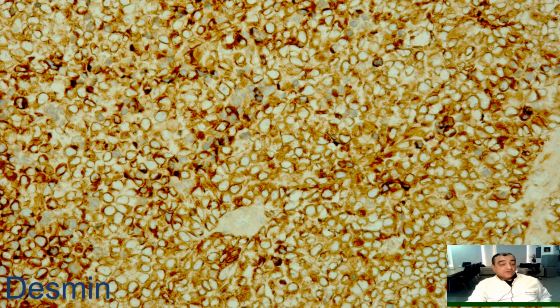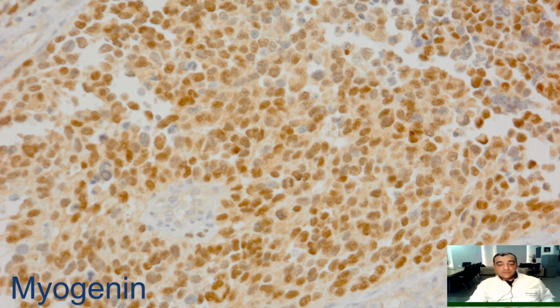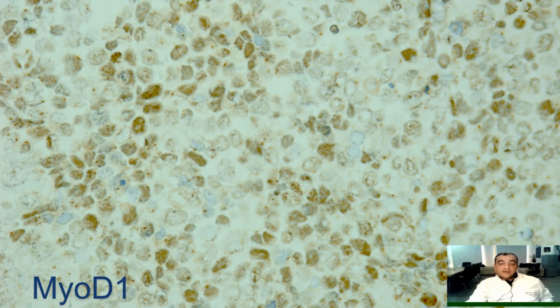And just to be sure that we deal with rhabdomyosarcoma, we do more specific immunostains that highlight the transcription factors, nuclear staining, myogenin. Here you can see the positive nuclear staining with myogenin, and positive nuclear staining with MyoD1, which confirms the rhabdomyoblastic origin of the neoplastic cells.